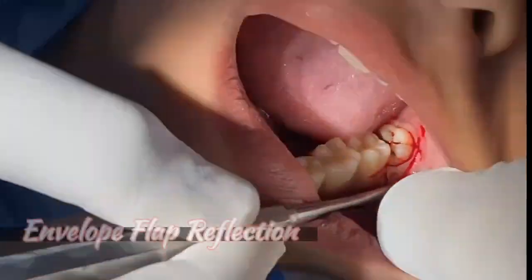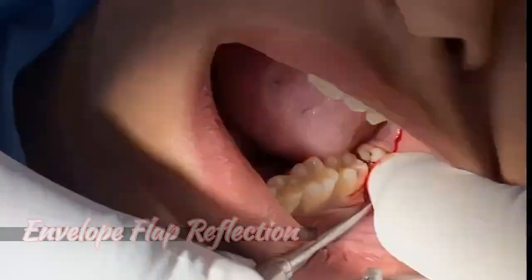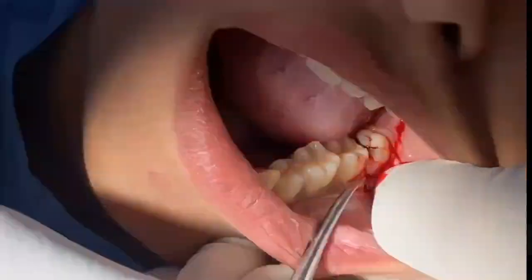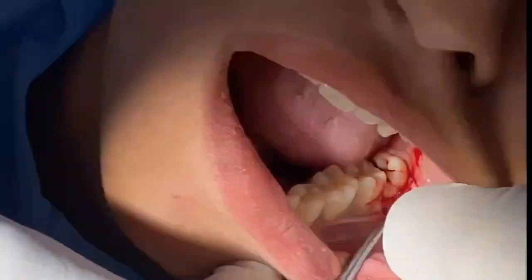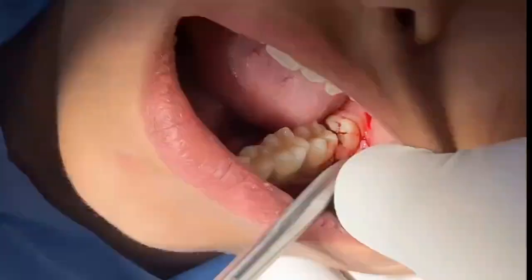This area we need to undermine properly so that the flap goes to the side. This is the junction which we need to release. See this — that's the junction. If the junction needs to release, then you can.